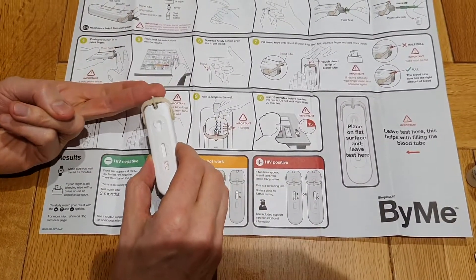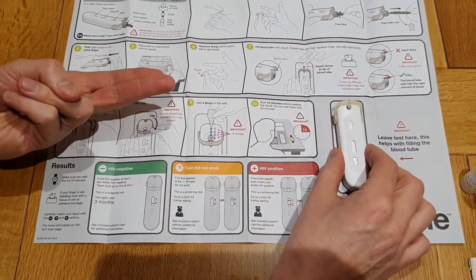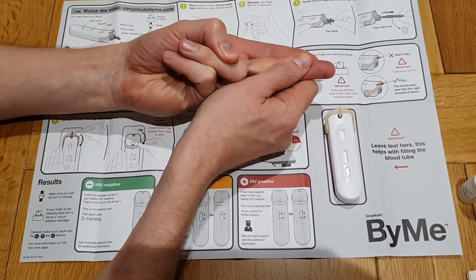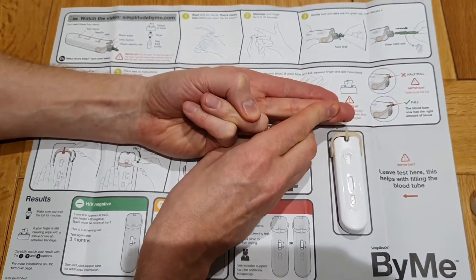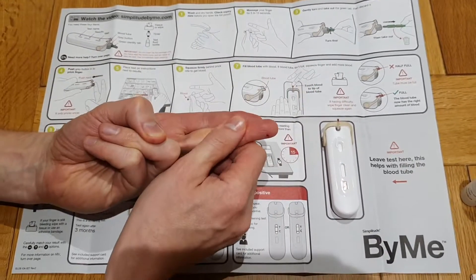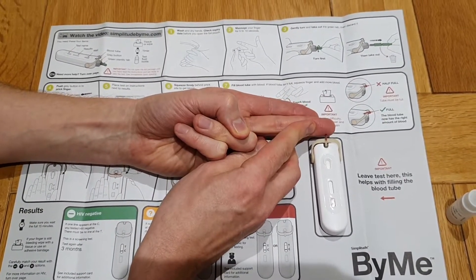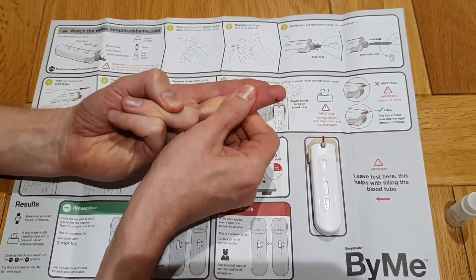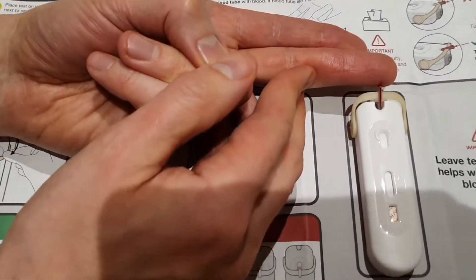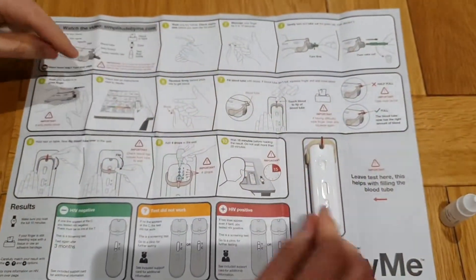Push hard. Okay, put that on the side and then I have to fill the tube up. More blood we need. Okay, so it's quite an easy thing to do to fill the tube up. That's four — okay, there you go. So it's four, what do we do now?